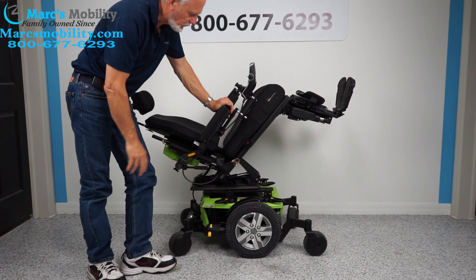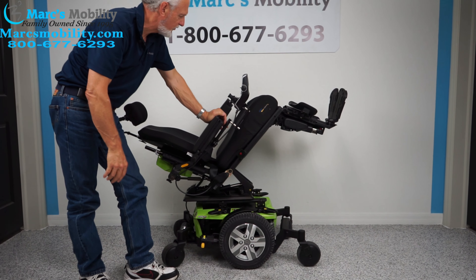That's your base right there. We're going to talk about the suspension in a few minutes, also on this chair.